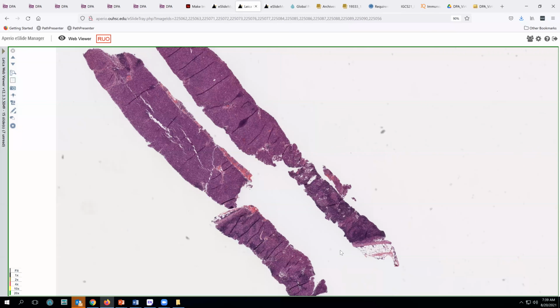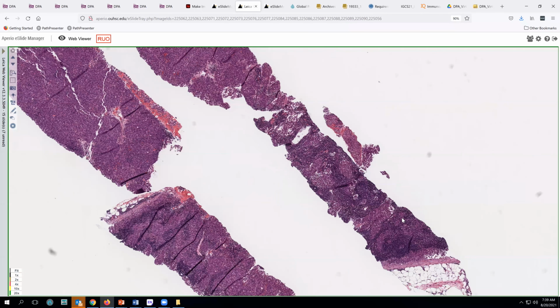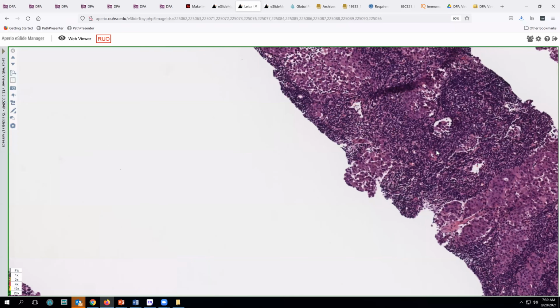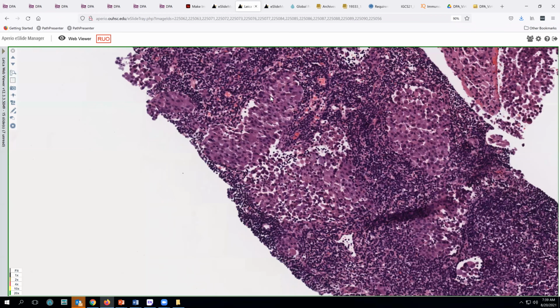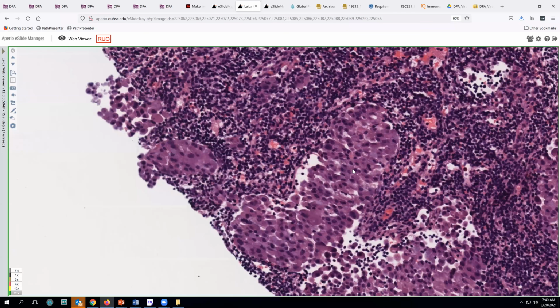Many of those patients may then undergo neoadjuvant treatment prior to a definitive surgery, and this is very helpful in that evaluation. So here we see a needle core biopsy, and we have just a little bit of residual lymphoid architecture here. And in this fragment, we can see that we have subcapsular tumor cells, infiltrative tumor cells in areas of the sinusoids. And we can see that this is a fairly solid tumor, probably nuclear grade 2 again.